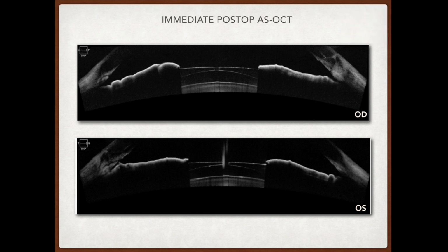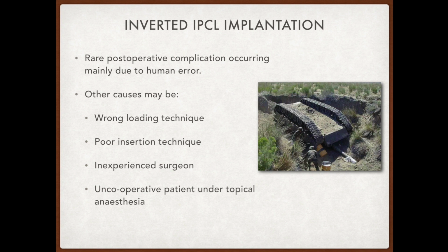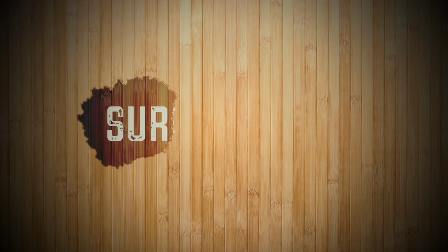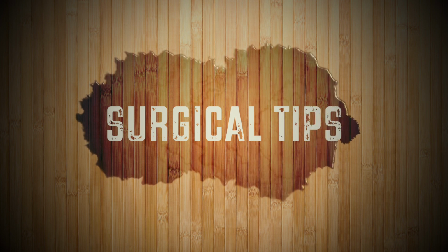Anterior segment OCT done in both the eyes post-operatively showed correct orientation and good vaulting. Upside down IPCL implantation is a relatively rare complication and most commonly occurs due to human error. The other causes can be wrong loading or poor insertion technique of the IPCL, inexperienced surgeon, and uncooperative patient under topical anesthesia. So here we share few surgical tips to prevent this avoidable complication.